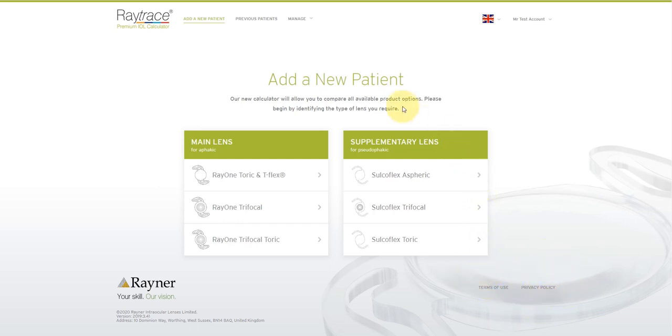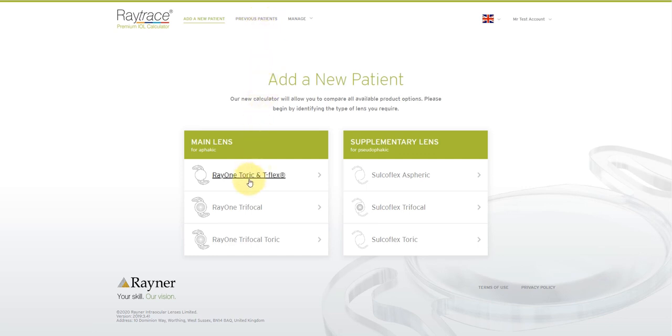You can access previous patient calculations from the top menu, and you can also perform a new patient calculation. So to do that from the homepage, select the lens that you're interested in. For this example, I'm going to select Ray1 Toric and there are options for main lens and also supplementary lenses.